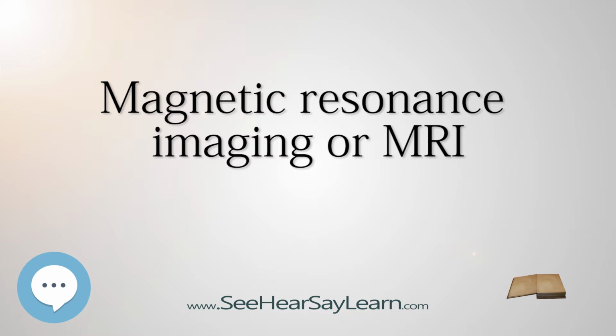A specialized, growing subset of interventional MRI is intraoperative MRI, in which doctors use an MRI in surgery. Some specialized MRI systems allow imaging concurrent with the surgical procedure. More typical, however, is that the surgical procedure is temporarily interrupted so that MRI can verify the success of the procedure or guide subsequent surgical work.